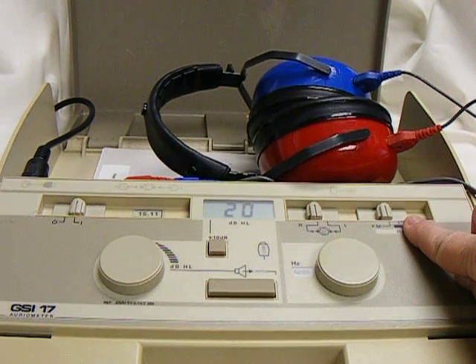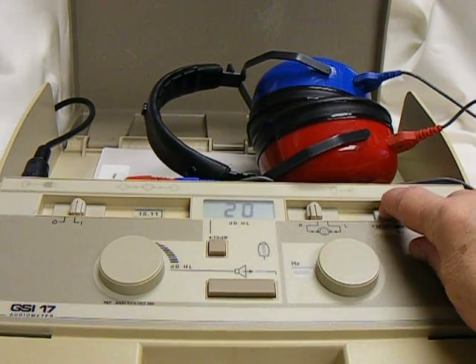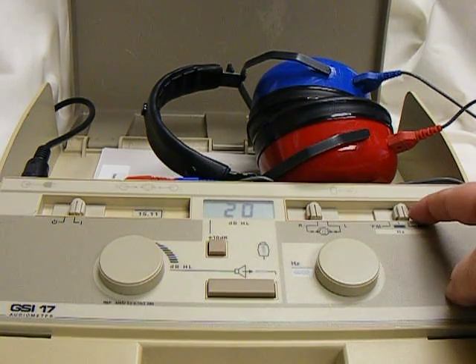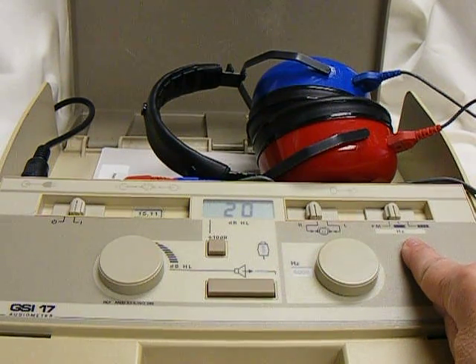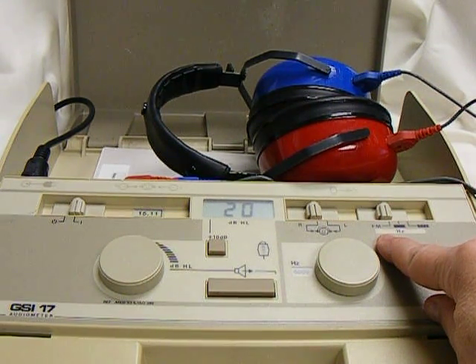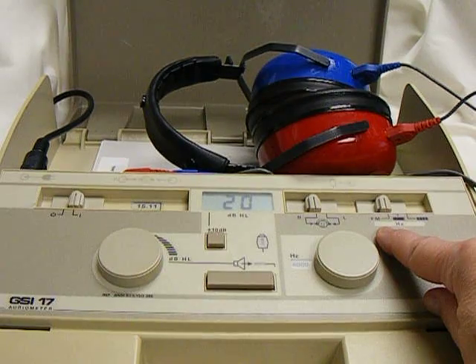This slider has three settings for your tones. The far right-hand setting is a pulse tone. The center setting is a pure tone, and the FM setting is a warble tone. The warble tone is easier to hear when there's background noise and that's our recommended setting.